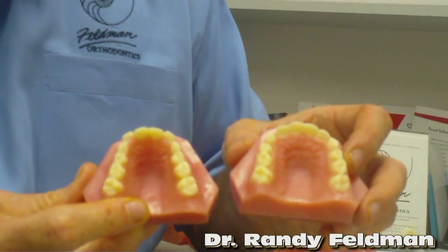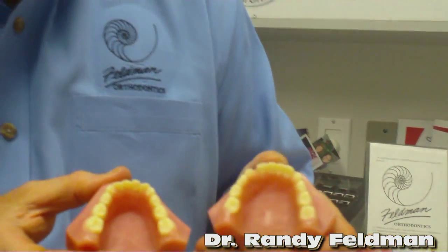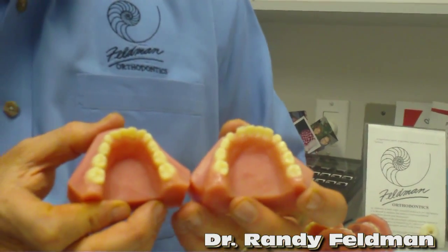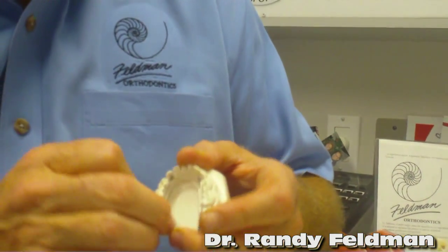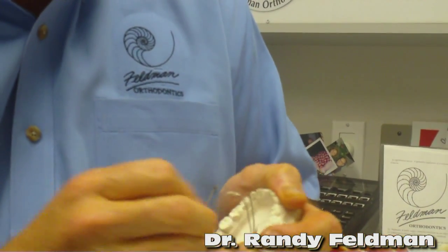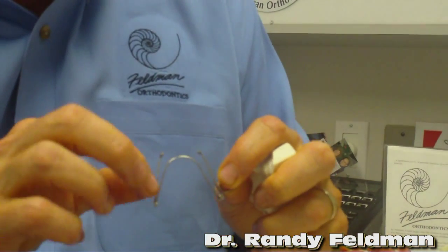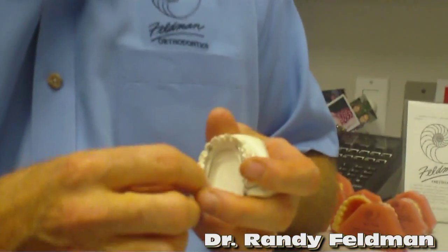That's the expansion appliance on the upper jaw. For the lower jaw, remember it was really, really narrow, and after we expanded it looked like this — we even created a little bit of extra room. We don't have a tooth missing. To do that we use something called a bi-helix on the lower jaw. Bi means two, just like in a bicycle — one, two little helixes. Same thing: we expand it, compress it, glue it in, and the lower wire fits just like that.